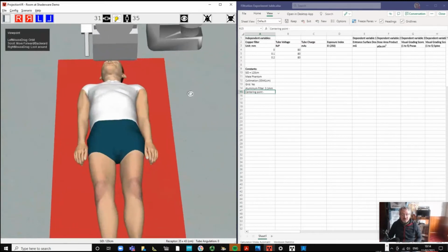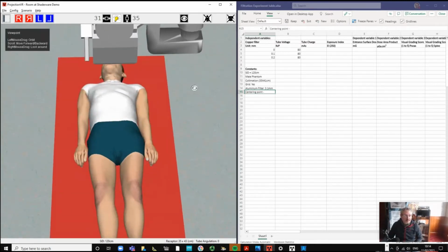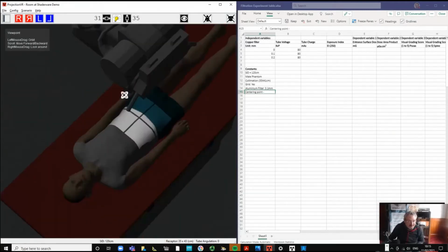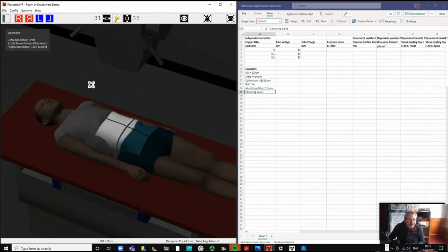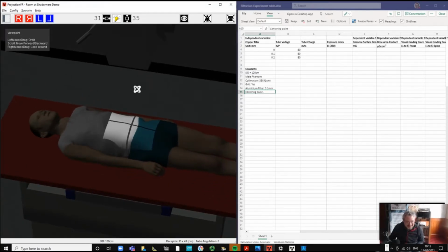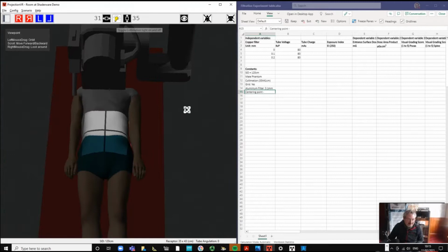You're going to have to write this in your method to make it reproducible, and it's something you can criticize the paper for, because it hasn't given all the information you need to reproduce it. It's the belly button, so you feel the iliac crest, and then you put your two thumbs towards the middle, and that's the centering point for an abdomen. Thank you, Claire.